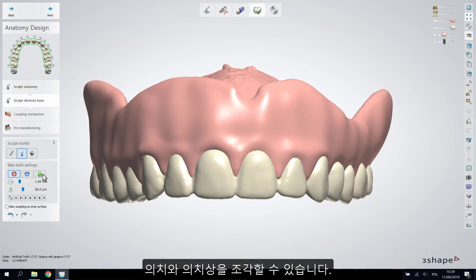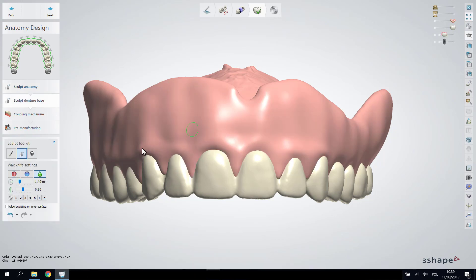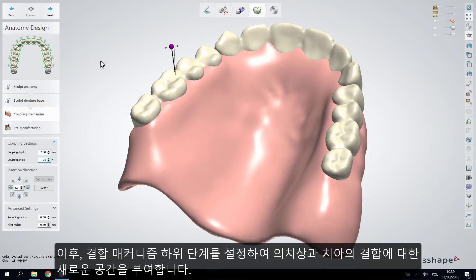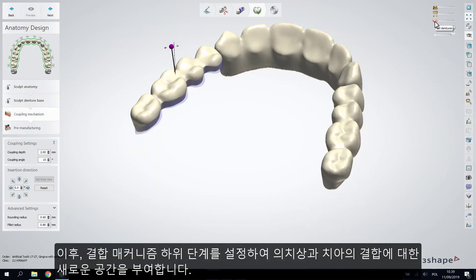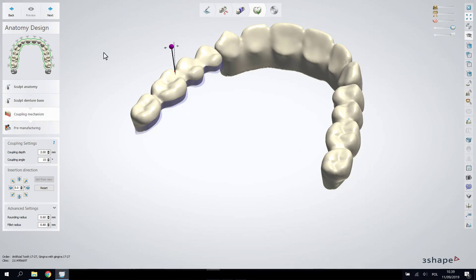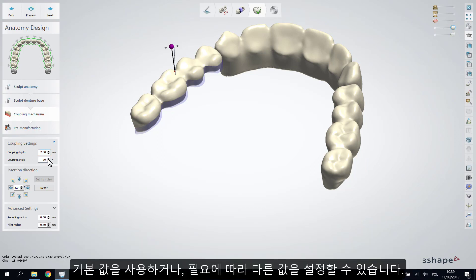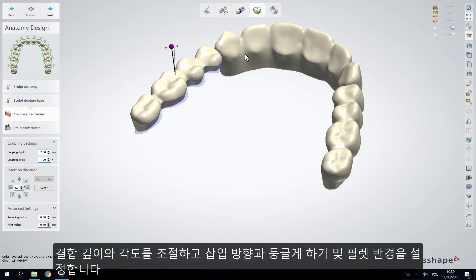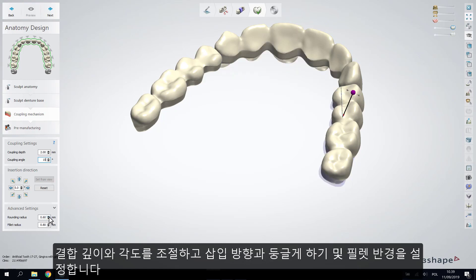Move to the anatomy design step, where you can sculpt the anatomy of the denture base using the Sculpt tools, just as you did for the full denture. Further on, set the coupling mechanism parameters to build the interface connection between the denture base and the teeth block. Use the default values or set your own depending on requirements — adjust the connection depth, angle, insertion direction, rounding radius, and fillet radius.